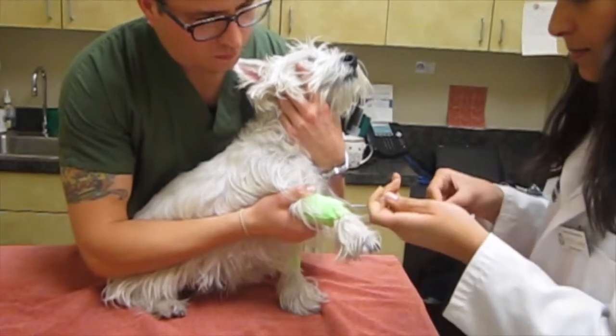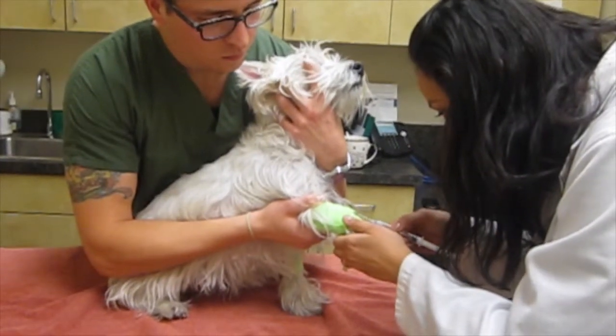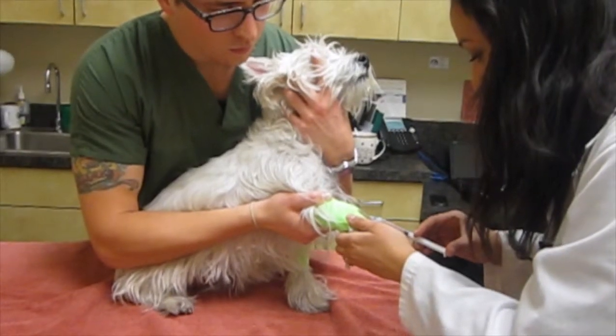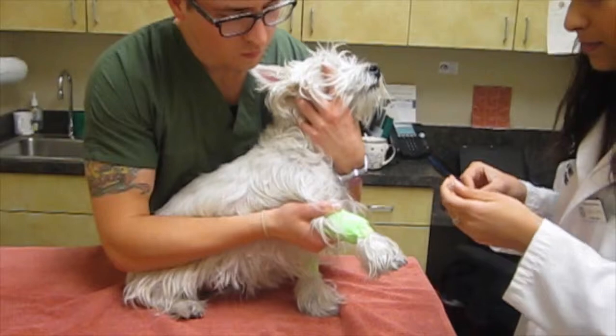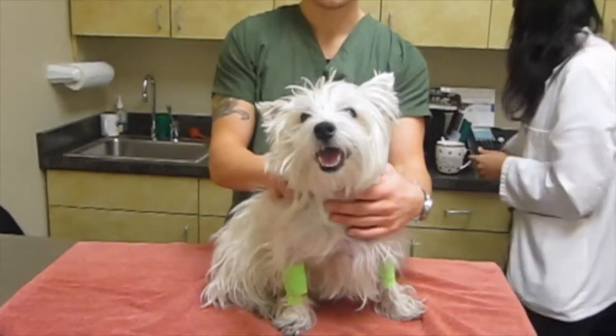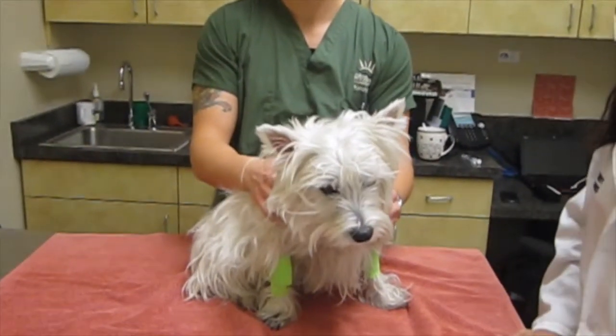We'll follow it by a saline flush to make sure all the sedation gets in. She has a catheter placed in her arm, and then she should pretty quickly get a little bit sleepy. We use very little sedation in allergy testing because it doesn't really hurt — we just need them to stay still.